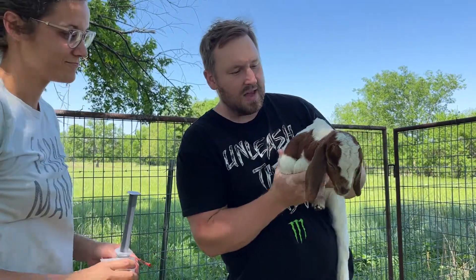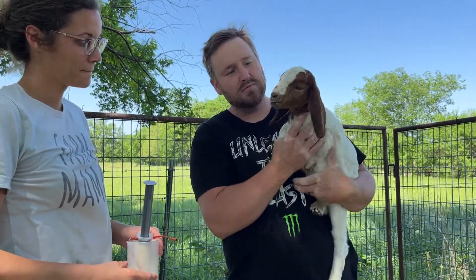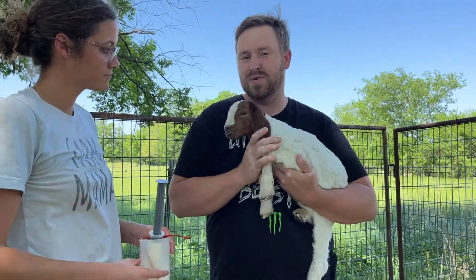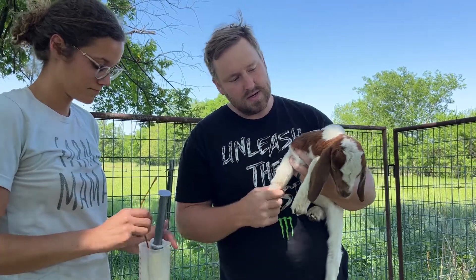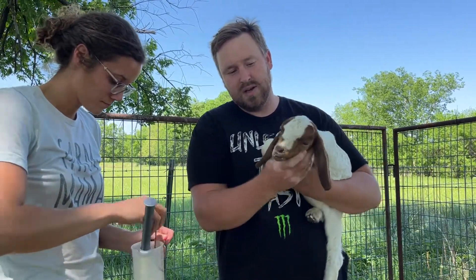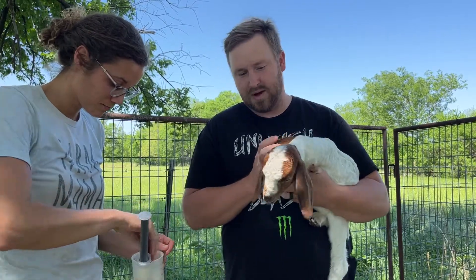Hey guys, we have a little goat that has goat polio. We'll probably do a video a little bit later to talk about that, but right now the big issue is he won't take a bottle and he won't eat. So we have to give him a tube, and we just thought we'd do a little video and show you how we do it.